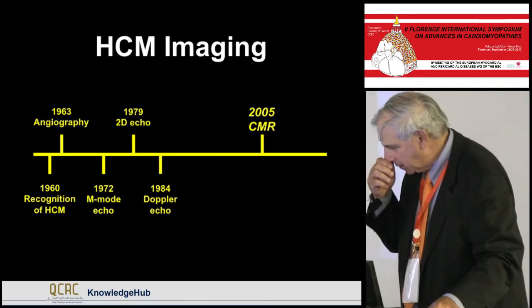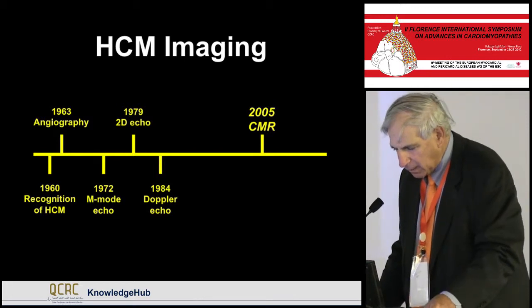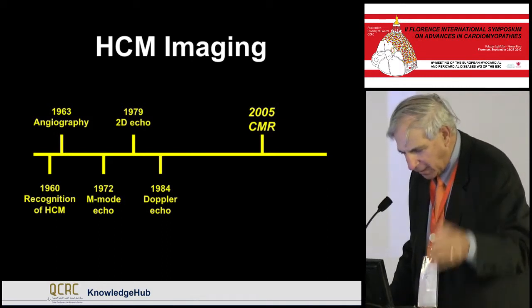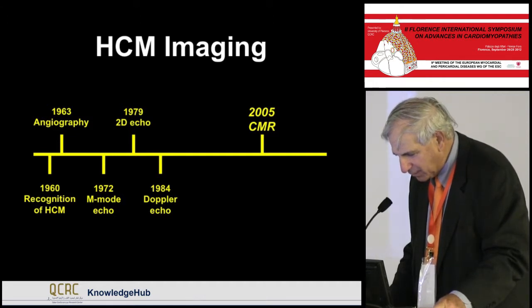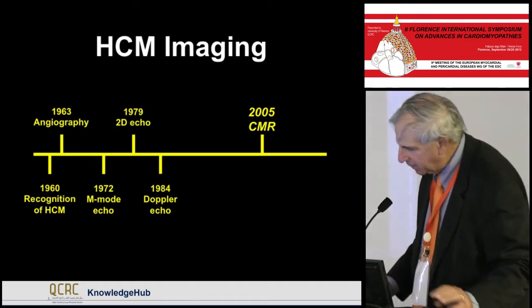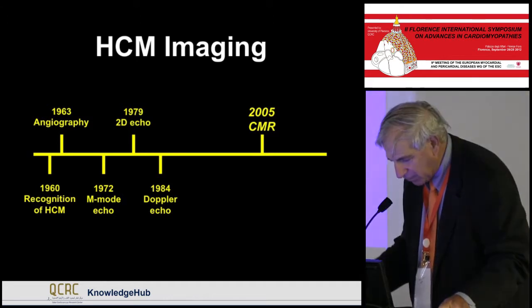The timeline for this, meaning imaging in hypertrophic cardiomyopathy, has gone through these phases from M-mode echocardiography, which is very old. There really wasn't much after the Doppler was invented to the time where we have really enhanced our ability to look at this disease, a disease which is very applicable to non-invasive imaging, obviously, as many people have already said.